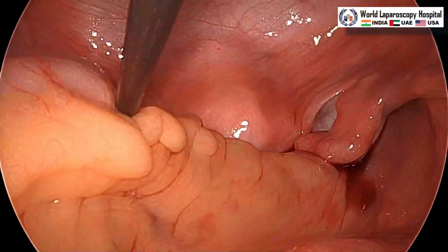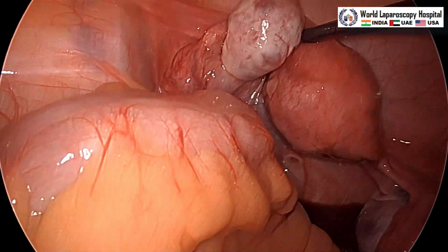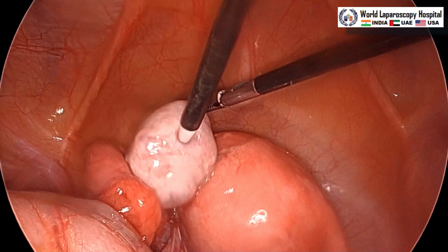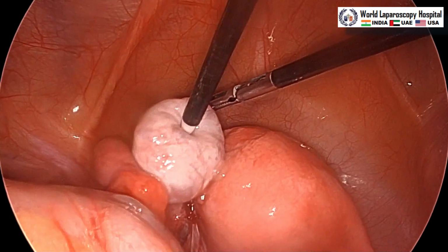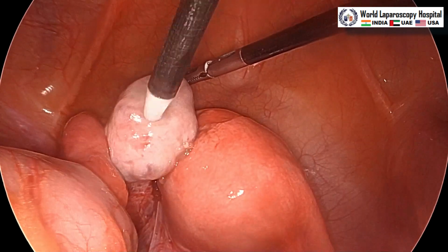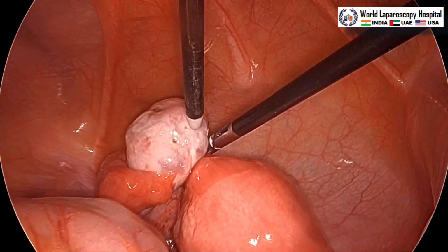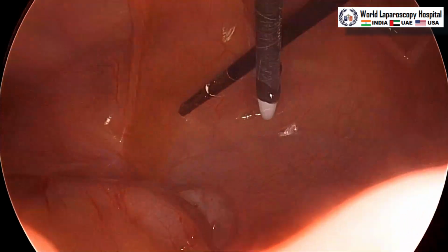Now from the anterior axillary line port we will put one grasper that will hold the ovarian ligament. And from the umbilical port we are putting the PCOD needle, and we will just puncture at the four poles of the ovary. Fimbria is visible as you can see on the left side, and this is puncturing with the PCOD needle, so that there will be no chances of burn and no adhesion. So only four poles we will puncture. Take care that this PCOD needle should not touch the tube. So this is the third puncture, and now one more puncture will be given.